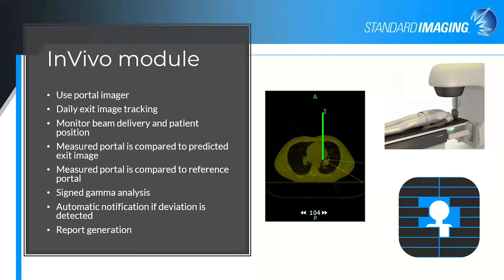So most often, physicists focus on this module as detecting setup or delivery errors for a specific day. Clinics report increases in quality of day-to-day treatment setup because there is an independent method in place to check the setup. Then additional training can occur if issues are noticed for specific types of cases. And one can argue that just because there is a process that exists and is in place to check this daily variation, quality improves. This sort of usage improves treatment quality, or in cases where large and/or repeated misalignment is discovered, plan changes can be considered to compensate for the misalignment.